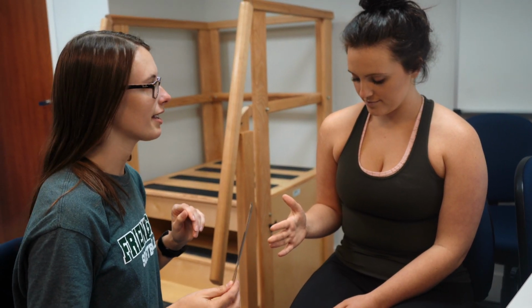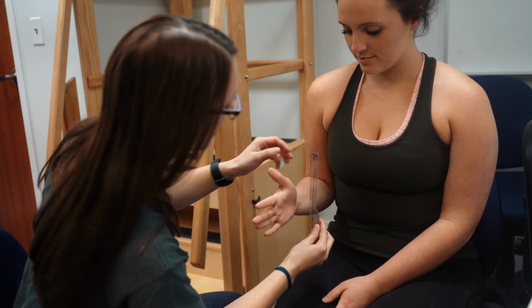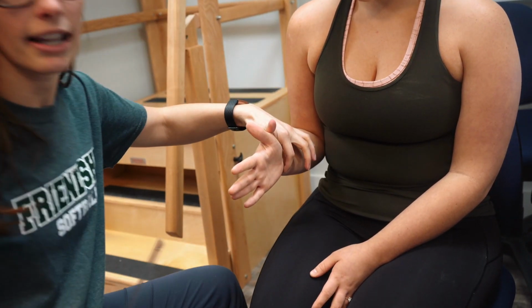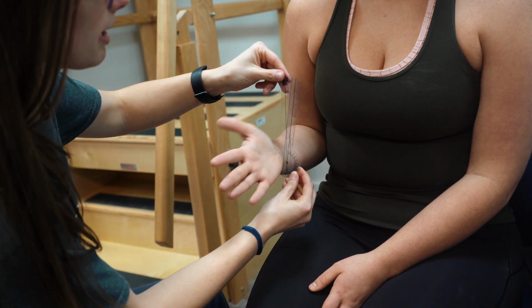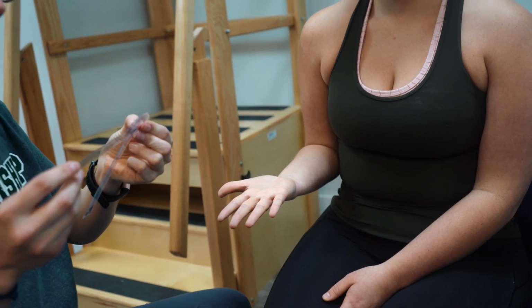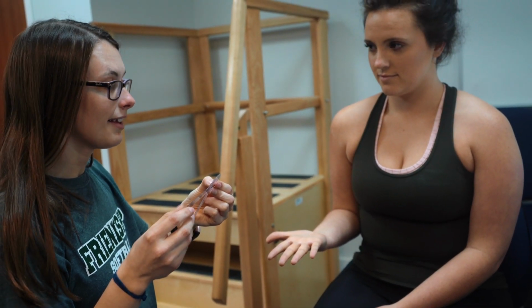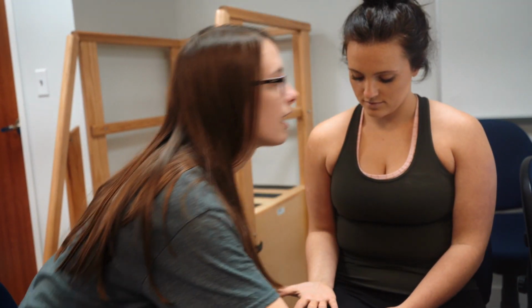Okay, I am measuring Kennedy's forearm supination, so she's going to have her arm aligned like this. I'm going to align the center of the fulcrum right here to the ulnar side of her wrist. So go ahead and supinate for me. Okay, so that should be at 85, which is in normal range, and the moving arm should line up to the lateral midline of the radial side of her hand, which is right here.